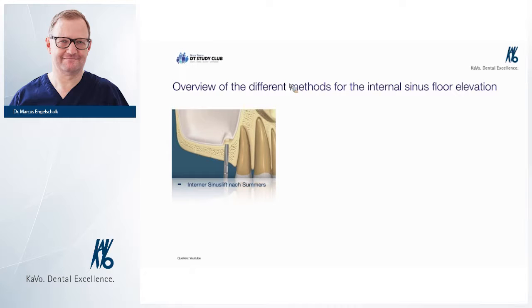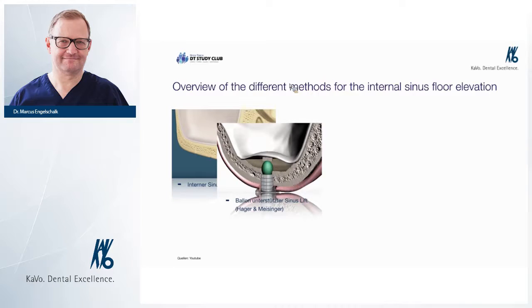So criteria for the internal sinus floor elevation, if we look at the aim, it should be minimally invasive for soft and hard tissue.